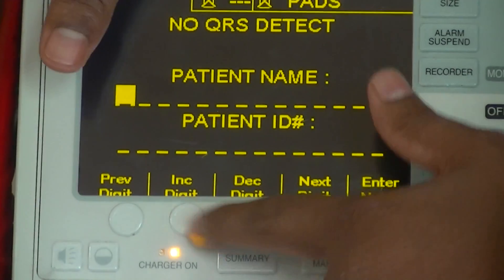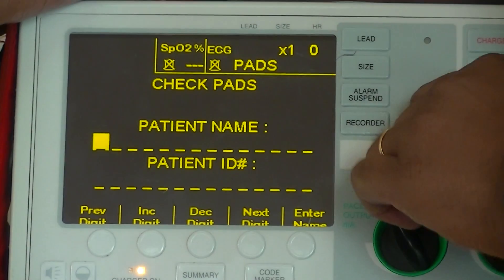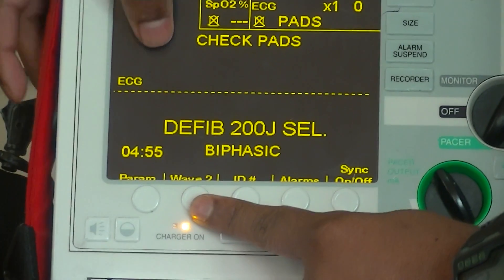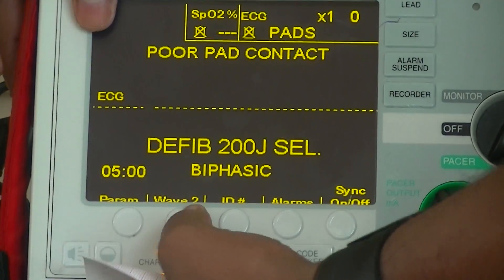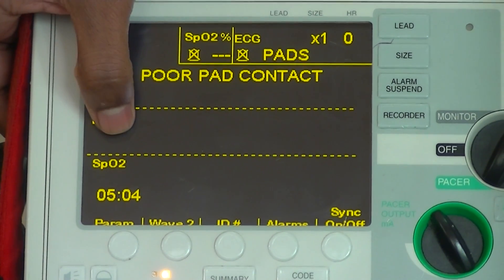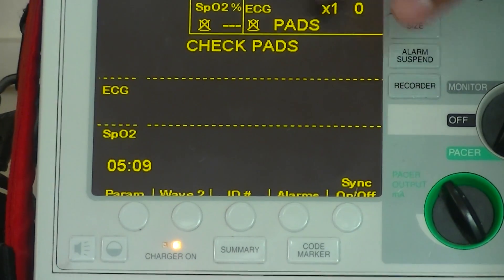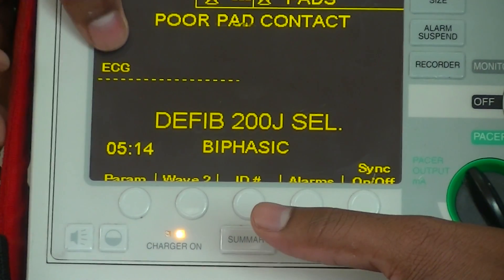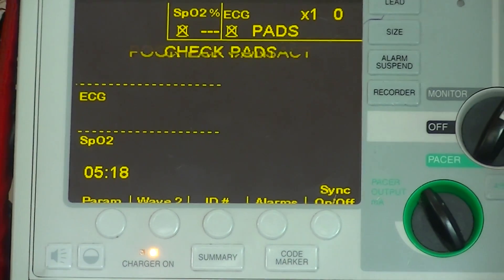For the patient ID, you can select it using the soft keys. You can see Wave 2 — there is one dotted line which indicates an ECG. Once I press this, I have the plethysmograph for SpO2 as well. So when you want to see both graphs on screen, you need to press Wave 2. And pressing it again goes back to a single wave. Pressing Wave 2 will give you both ECG and plethysmograph.